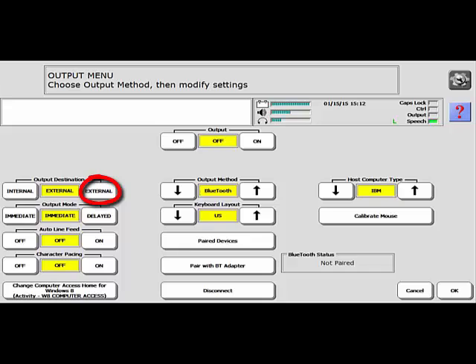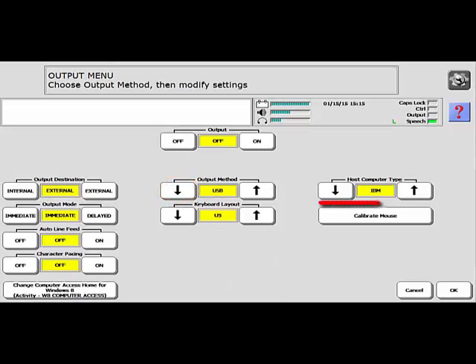Look to the left and set the output destination to External. Set the output method to USB. Then set the host computer to either IBM, which is a PC computer, or Mac, which is an Apple computer. In this example, I connected my Accent device to a PC computer, so I will set it to IBM.